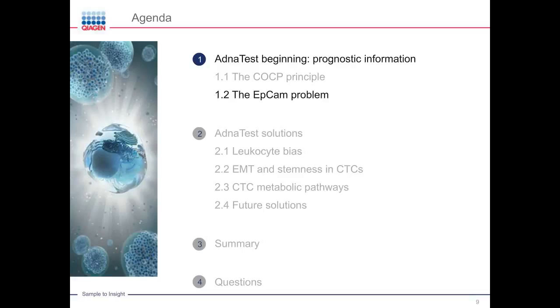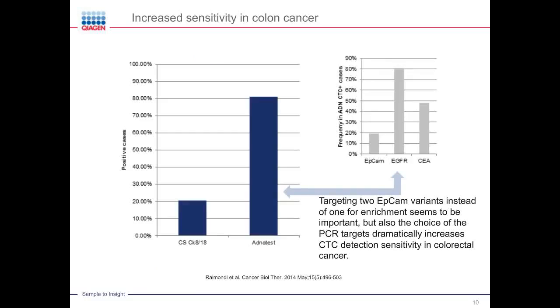But as I told you, this is unfortunately not true all the time, and this is also different in many cancers. And by using this immunomagnetic antibody bead mixture, you really can overcome at least most of this challenge here.